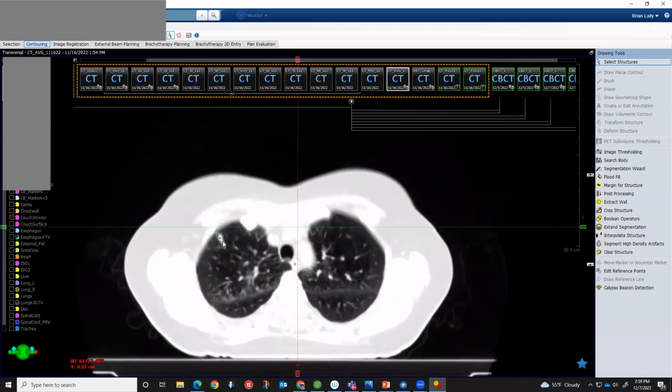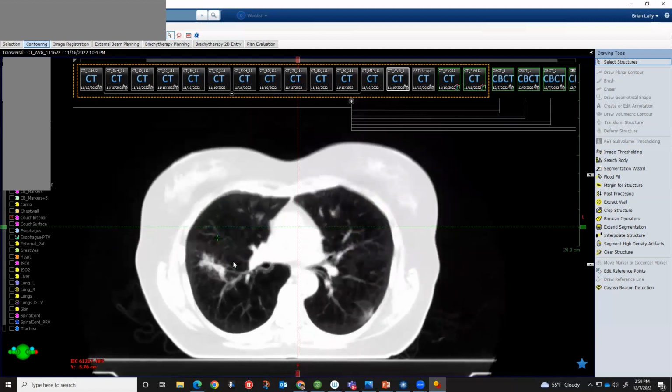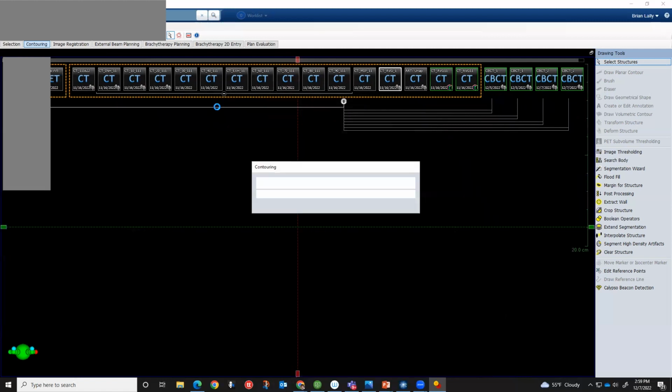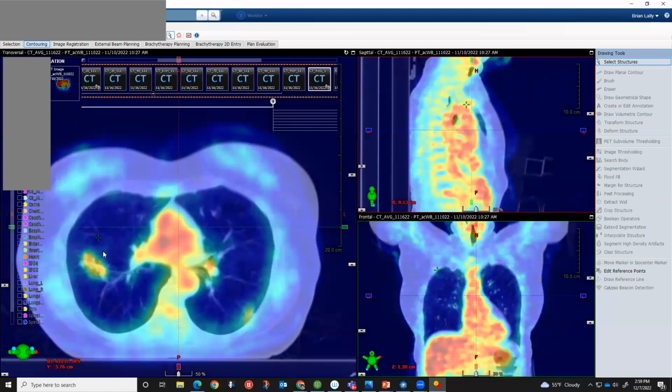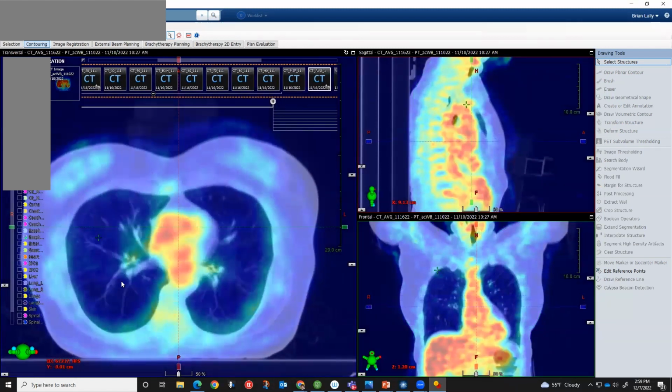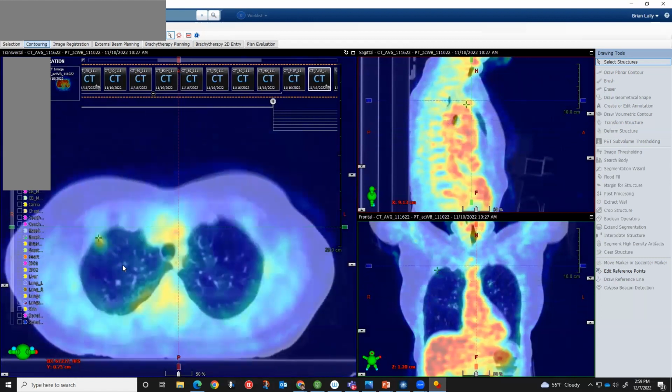This patient here has a lesion in the right upper lobe that you see there that was biopsy proven to be a lung cancer, as well as a second lesion right here that was also biopsy proven to be a lung cancer. So the first thing I want to show you is, in this patient, we have the ability to fuse in their PET scan. So we can see where the PET scan was positive on this patient. And you can see there's uptake at that lesion, as well as in that lesion there.